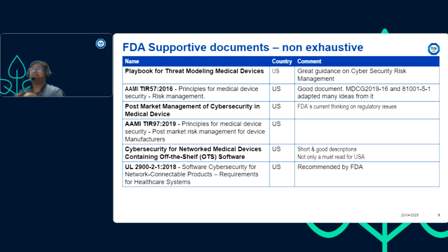So first and foremost for FDA is the pre-market submission guidelines. The pre-market submission guidelines tell us about all the nitty-gritty requirements from the FDA. And now we have the eSTAR submission format, which many of you might have already seen. It is a very easy and interesting one where you get a simplified version of all the things. You just keep answering the questions, it will keep populating new questions, and you just need to select the right files at the right location, and with ease of access, all those things can be submitted and easily handled.